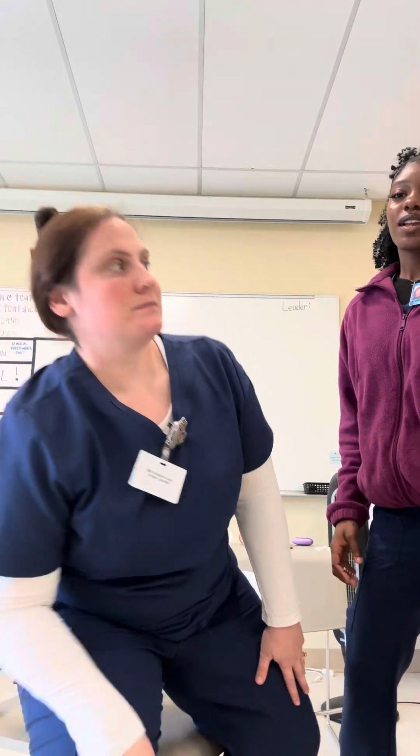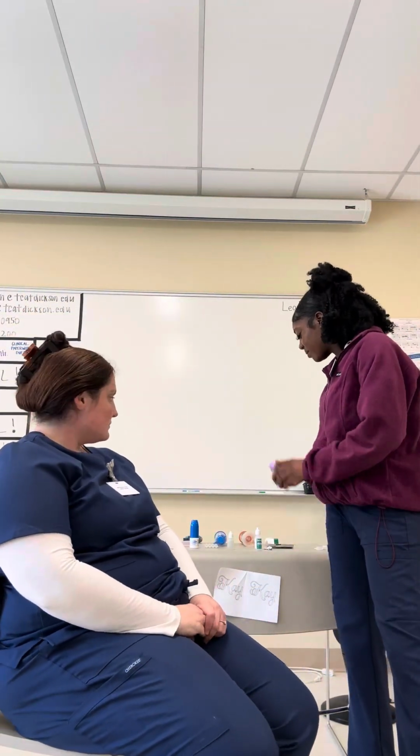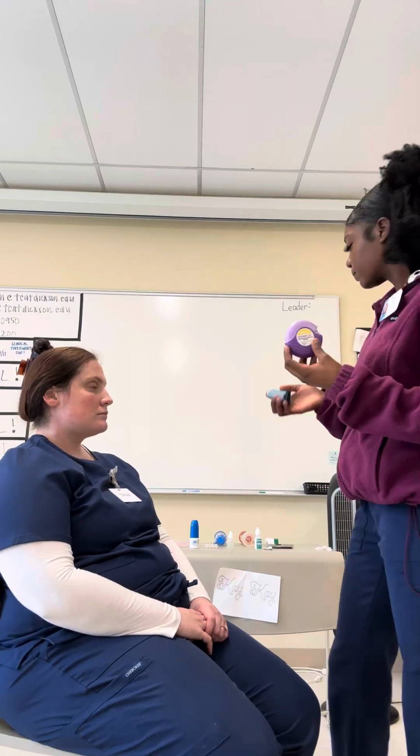And then we have inhalers, and we have two types of inhalers. So we have a meter dose. I think this is the most common, and it counts how many sprays that you have left after you just used it. And then we have powder inhalers. These dry powder inhalers administer powder, and after you administer this, you have your patient swish water in their mouth.